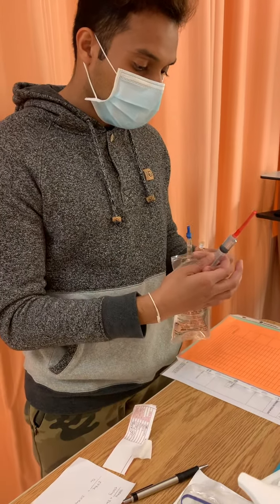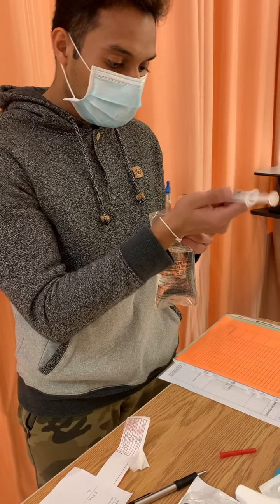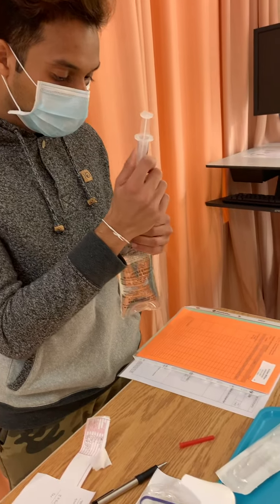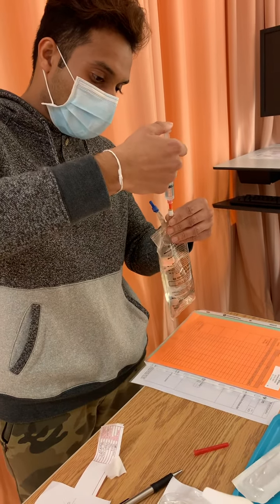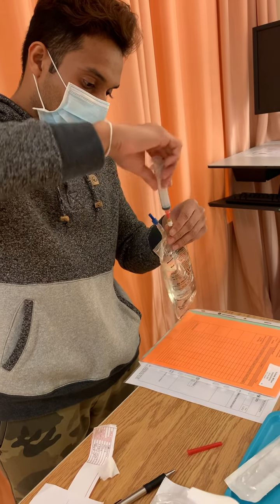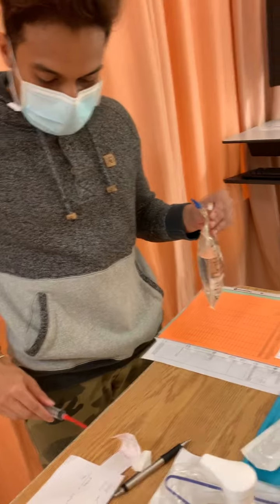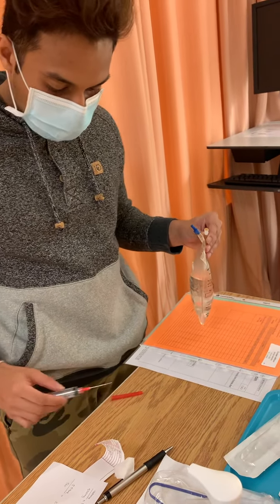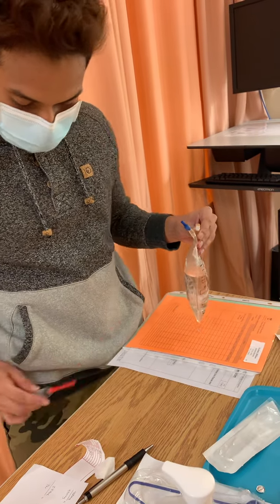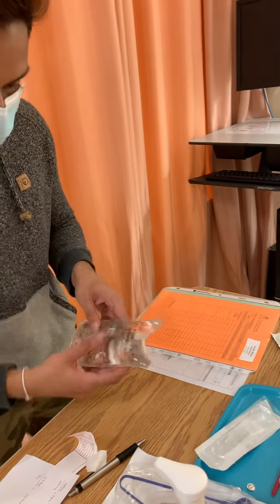We're going to inject the medication in. We see it's a new bag. It's not broken or anything. We're injecting into the center to make sure not to perforate the bag. So we're doing that. Okay, injecting the medication in. Okay, taking it out. And we're getting rid of this in the med waste because we no longer need it. Okay, so we're just going to gently mix this.